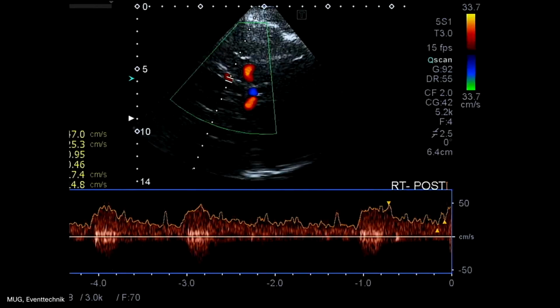So on this image, you see another example that we did in our Sono lab at the neurology department. It's an intracranial vessel, a cerebral vessel. And we wanted to see if there is vasoconstriction in this patient. So you can also get the flow profile of the vessels and get a lot of information out of that. But again, you need to know the settings, you need technical, physical basics, and it's a topic for another talk. But whoever is interested in that can come by the neurology department in Steyr, and we will have a closer look at it.